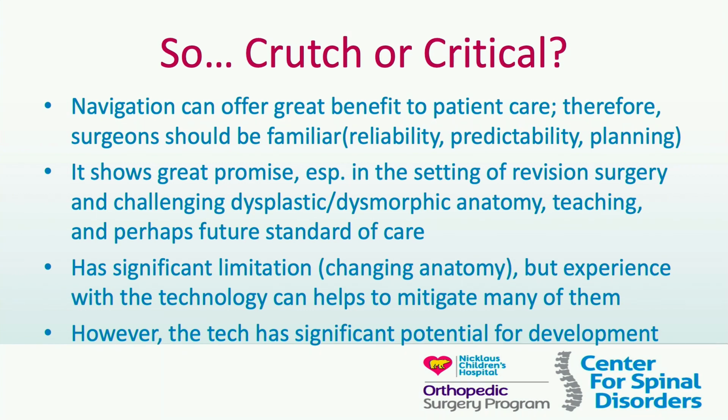It does have significant limitations, such as changing anatomy. When you talk about deformities that change as you actually do the surgery, I think navigation still trails in its ability to adapt to that. There are some things that we use, such as additional fiducials, to re-register intraoperatively to make our imaging or navigation more accurate as the deformity changes during surgery.